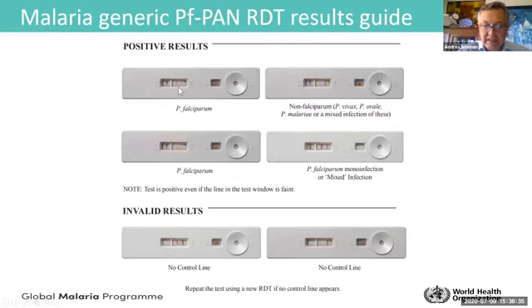If I have a result like this, I am very clear. I know that this is a non-falciparum malaria. It could be Vivax. And if I know that in my country I don't have any Plasmodium malariae, maybe this needs Primaquine as well. Could be ACT plus Primaquine.